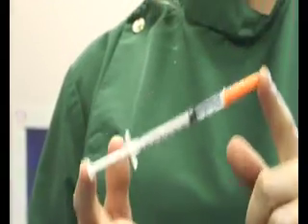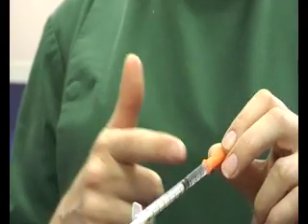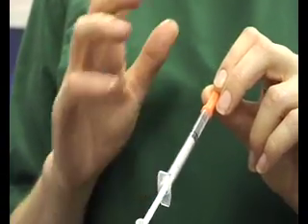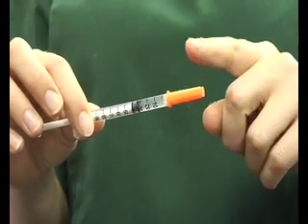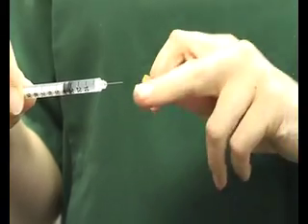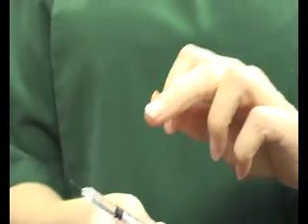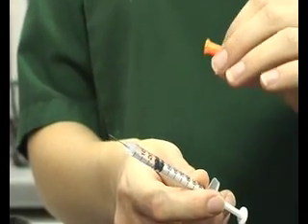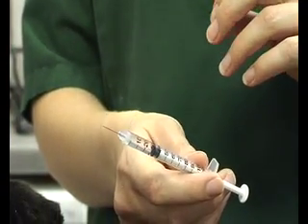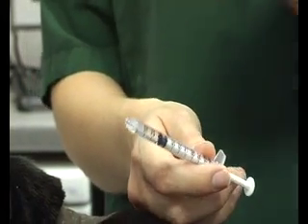This is a typical example of an insulin syringe. They're very small and very thin. The graduations along the side indicate how much insulin you need to give the cat. They all have a little cap on them — pull that off. Make sure you pull straight and clean because the needle is very soft and will bend if you catch it. You can see that the needle is absolutely tiny. The cats will very rarely feel it going in — hardly any of them will make a fuss. So don't worry about hurting your cat; it is definitely worth it.